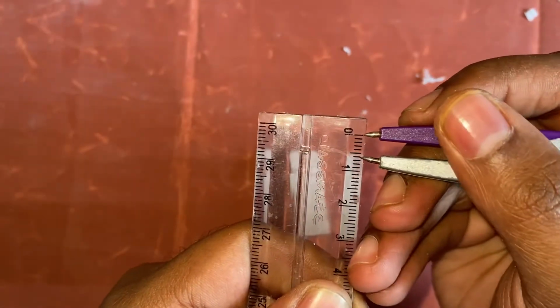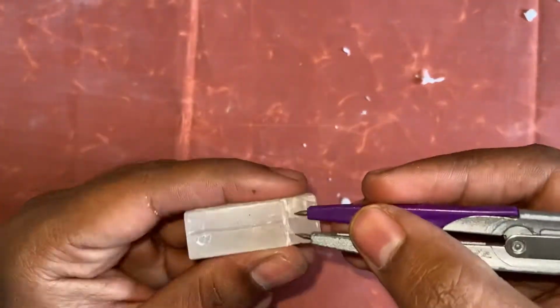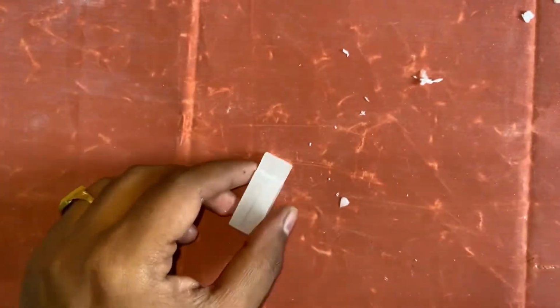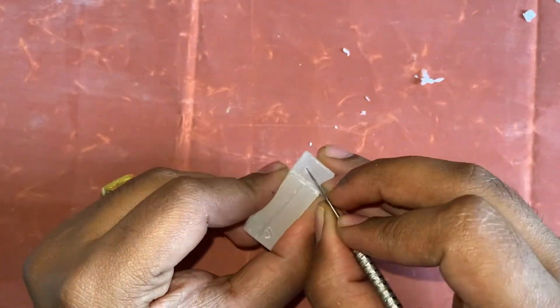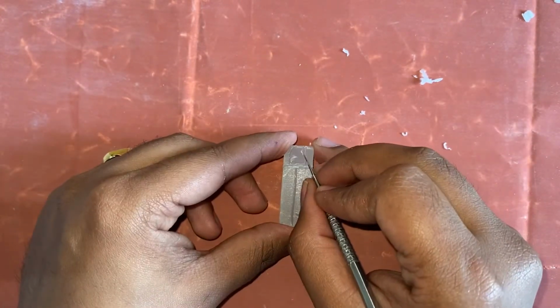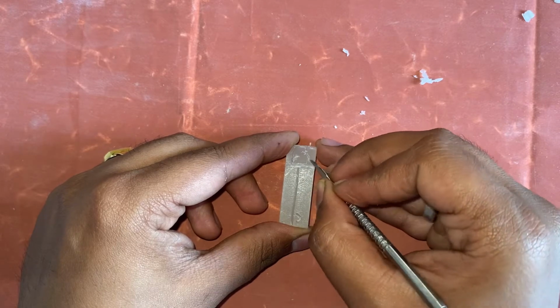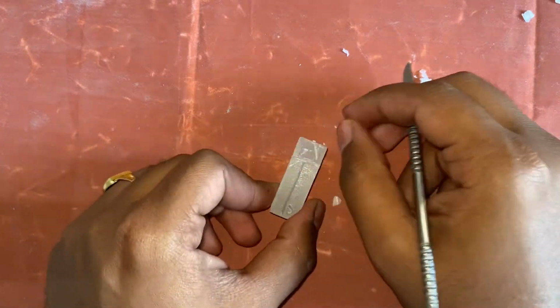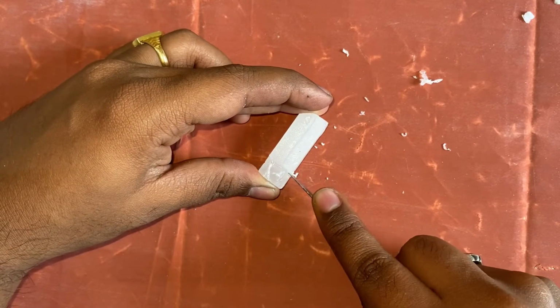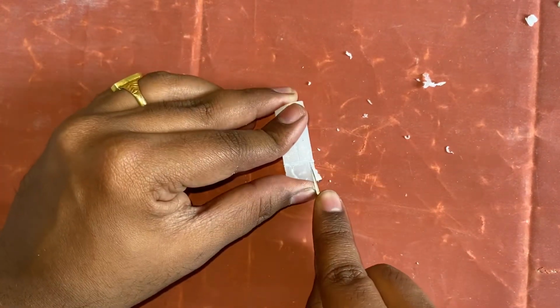So now we are measuring the buccolingual diameter of the crown, that is 6 mm, and we have marked it on the wax block. We are giving an outline of the crown on the buccolingual side. So you can see that the crown is tapered towards the incisal edge.